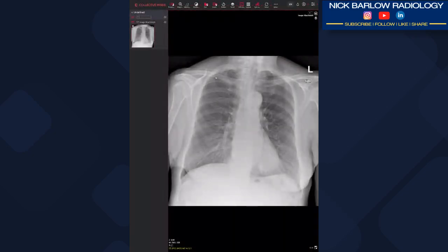Hello guys and welcome to Nick Barlow Radiology. This is a short chest case I reported this morning. The patient came in with non-specific chest symptoms — fever, aches, ulcers — and they're an ex-smoker. So we're looking for any underlying lung pathology.